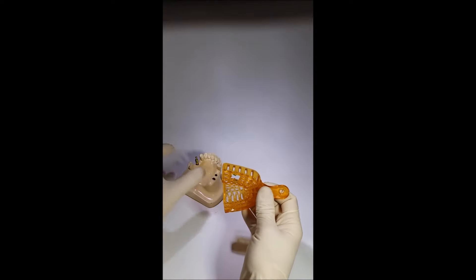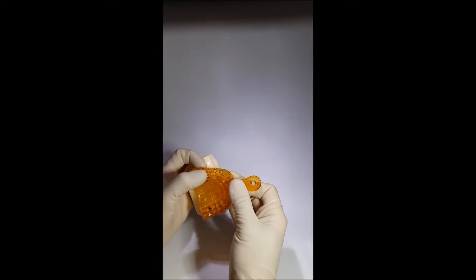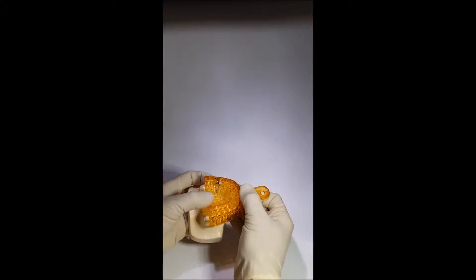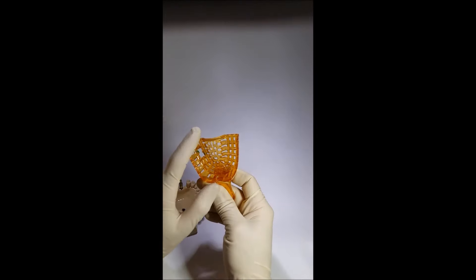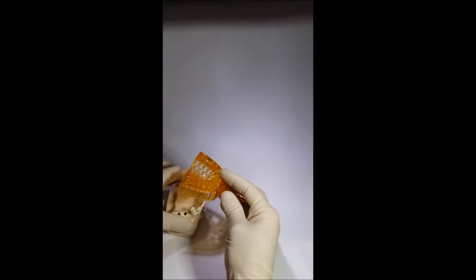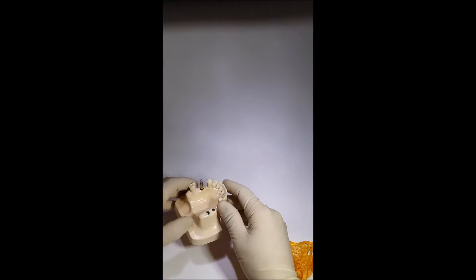Once the hole is created in the chosen area, we should check the transfer again so the screw goes through the hole easily. Then we knead an impression paste, put it in the area, and take an impression. The advantage of this technique is its accuracy among all existing methods, as the transfer is fixed absolutely tightly with a screw and does not move.